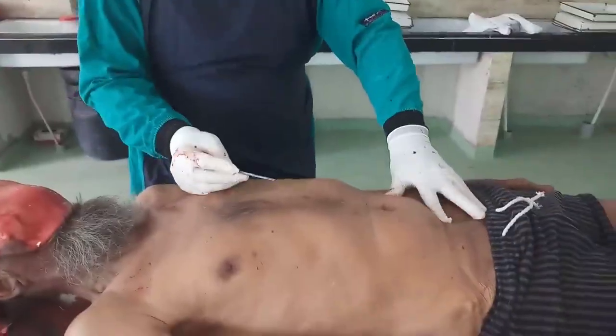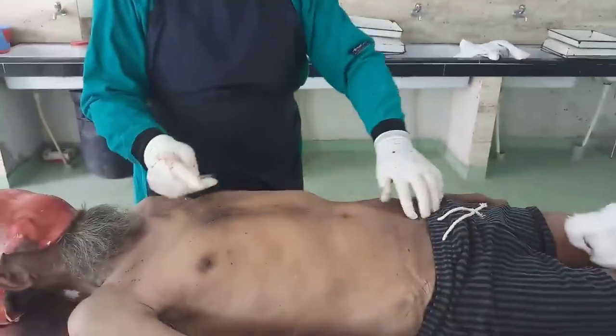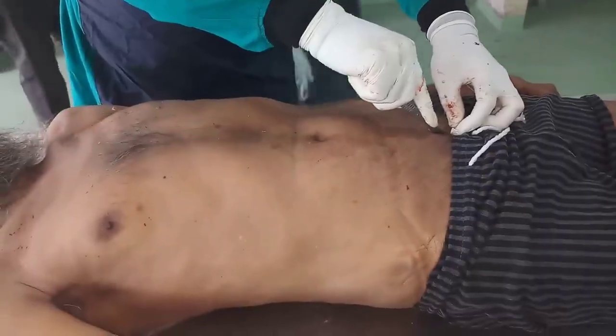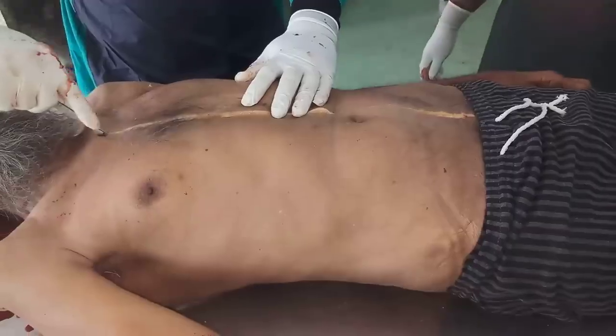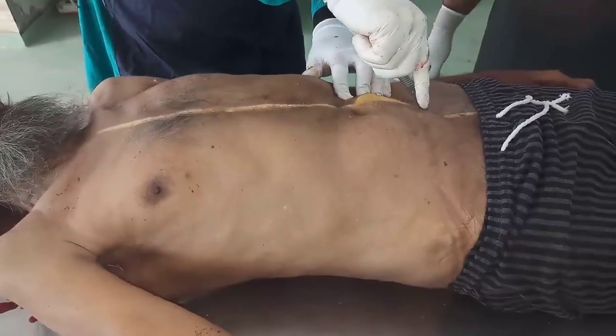Now we will open the abdomen and the chest cavity. For that, an incision is given over the pubic symphysis, sparing the umbilicus, till the sternal notch. We'll deepen this incision.